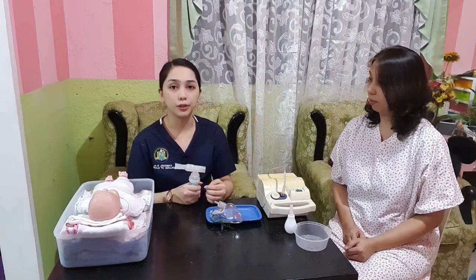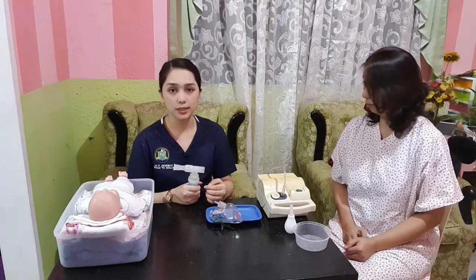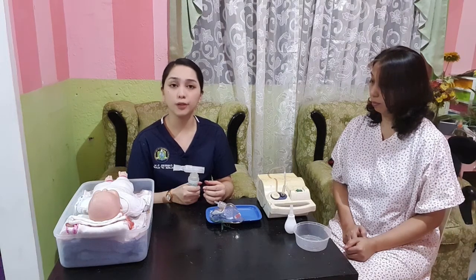Then I will now turn on the nebulizer machine and ensure that a sufficient mist is formed. So this verifies that the equipment is working properly during delivery of medication.